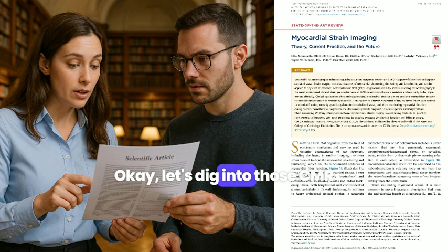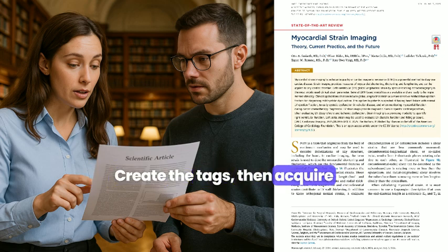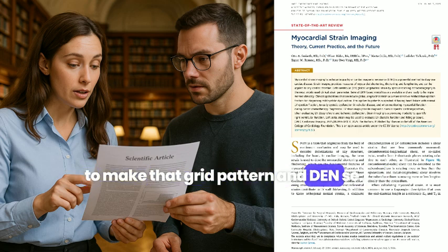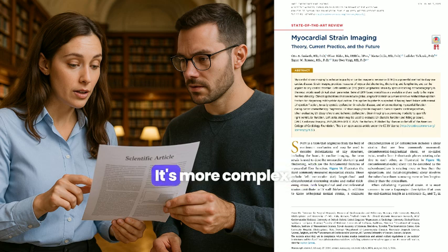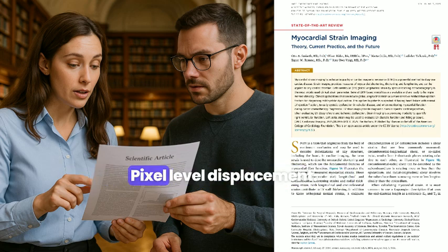Okay, let's dig into those CMR tagging techniques a bit more. Spatial modulation. Right, that's the most common one. It's a two-step thing. Create the tags, then acquire the images tracking them. Spatial modulation uses specific RF pulses to make that grid pattern. And DENSE, that sounds intense. Yeah. Displacement encoding with stimulated echoes. It's more complex, uses a different pulse sequence, but gets you really high spatial resolution, pixel-level displacement.